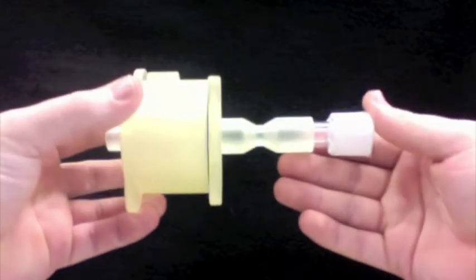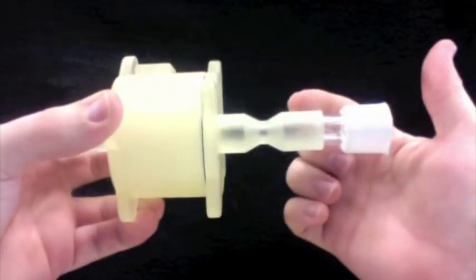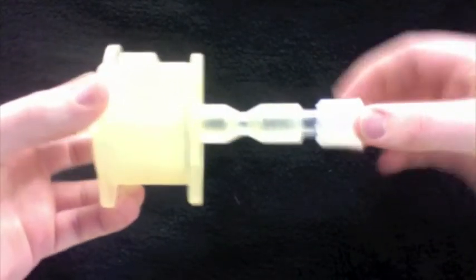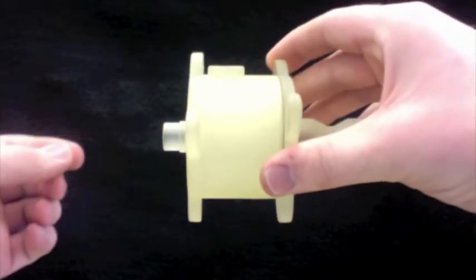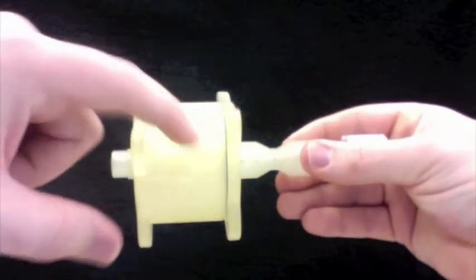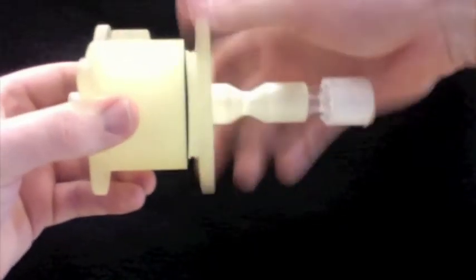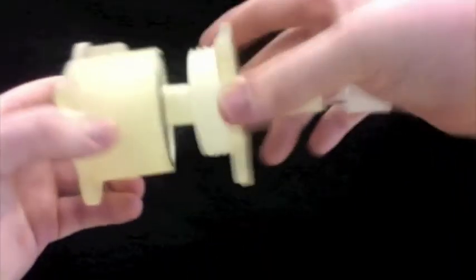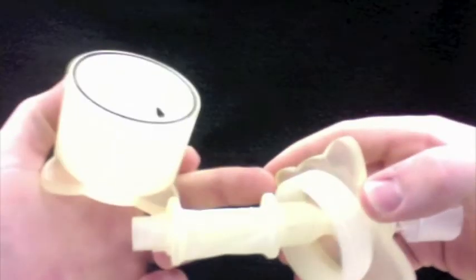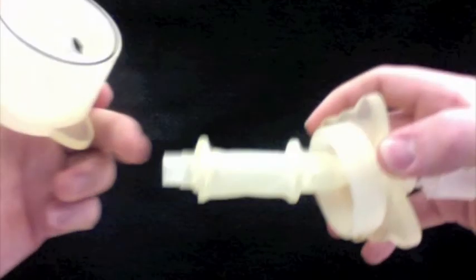Alright, so here's our device. We have the venturi tube on this side right here with the 3 pressure taps as we described before. On this side is where the patient will be breathing, and on this side is where the ventilator will be attached. So here's the outer chamber. On the top there is a port where we will input our pressure oscillations, and for ease of use we have this unscrew, where on the inside we have an O-ring to keep a pressure seal, and the latex sleeve which creates the sterile membrane.